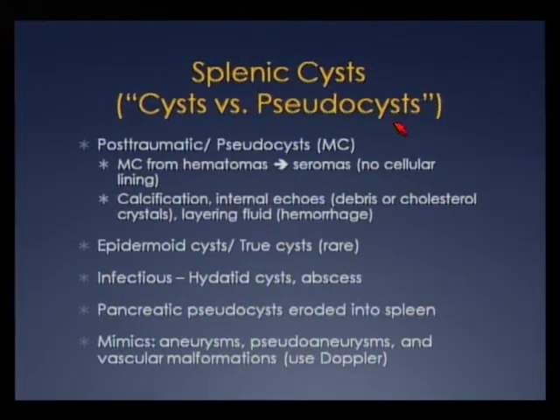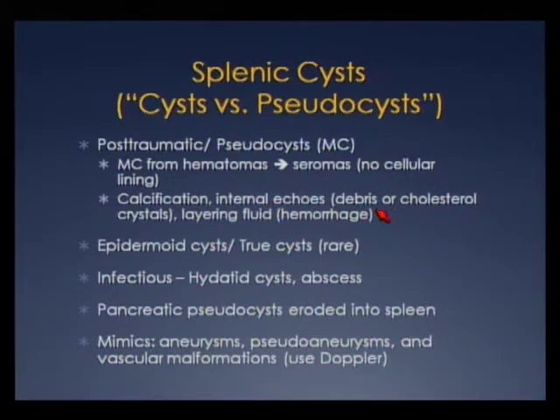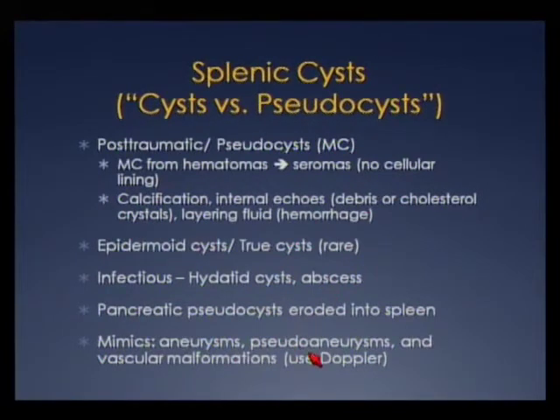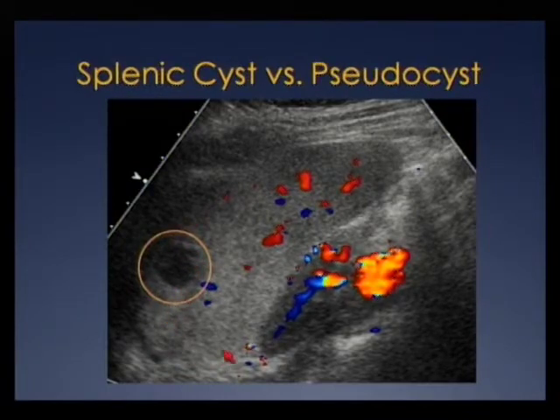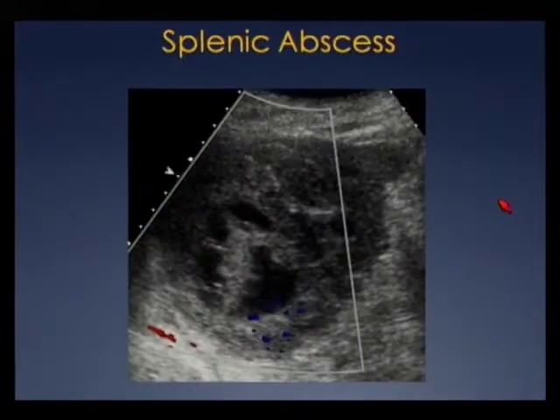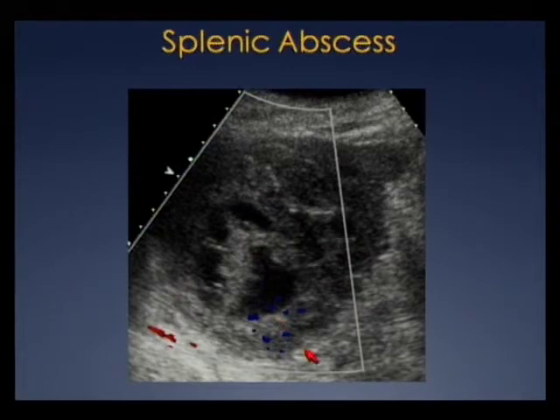Splenic cysts versus pseudocysts — most are actually pseudocysts, not true cysts, derived from hematomas that have evolved into seromas. They don't have a cellular lining and may have a complex appearance with calcifications and internal debris. Epidermoid cysts or true cysts are rare. Other etiologies include infectious cysts and pancreatic pseudocysts eroding into the spleen. Vascular lesions can mimic cysts — remember to use Doppler. Here's a hypoechoic splenic lesion with irregular margins but increased through-transmission and no Doppler flow, called a cyst versus pseudocyst. Another patient has a complex cystic lesion with debris and increased through-transmission in a sick patient — this was a splenic abscess.